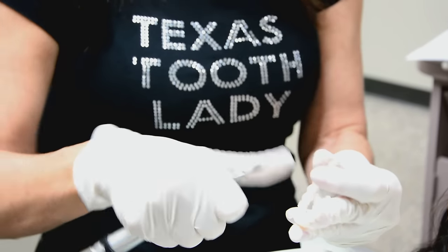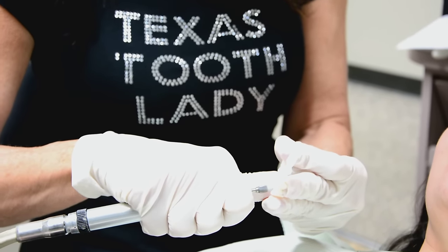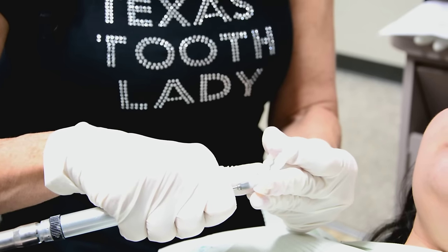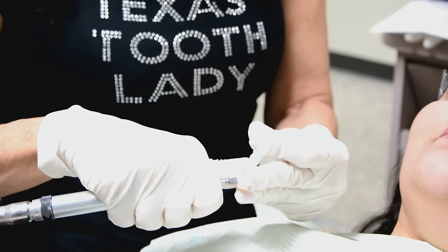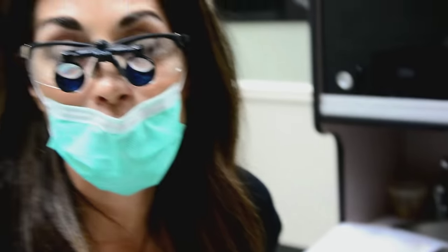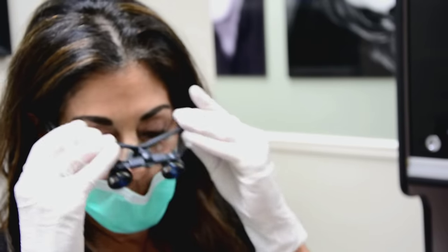Sometimes it'll take a while — just like on a denture, it takes the patient time to get used to it. You can have them back in a couple of weeks for further adjustments. After final adjustments, we finish polishing and go over all the care instructions, including the snap-on smile powder and gel that comes with the appliance. Basically, this is a quick review of how to do the snap-on smile from start to finish. Thank you.